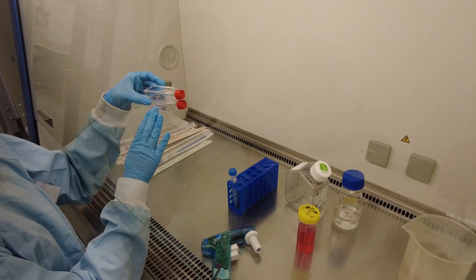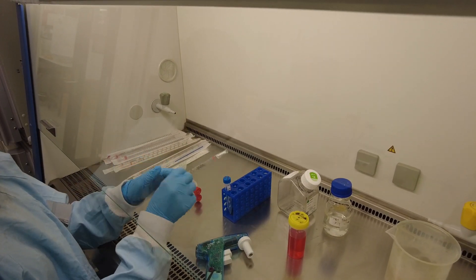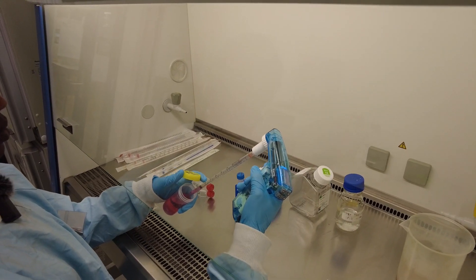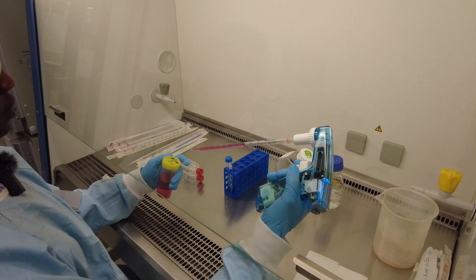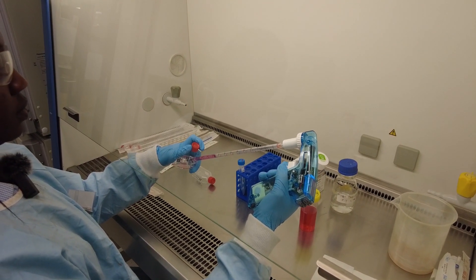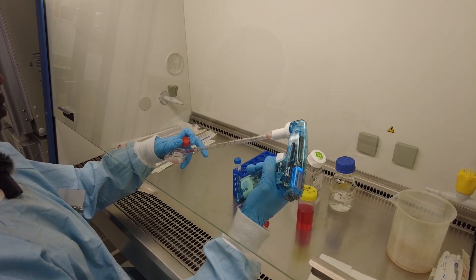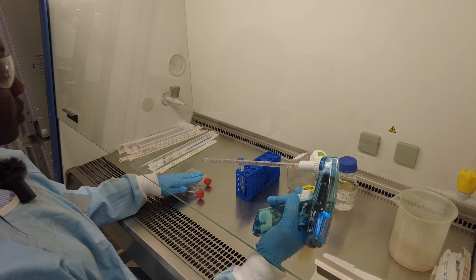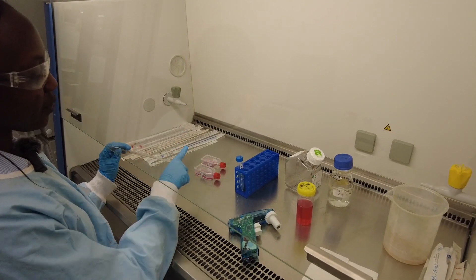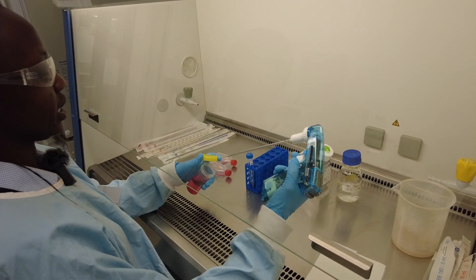We're going to put four mils of fresh EMEM media into each of the flasks, and then put the cells into the flasks as well. Four mil into each. Then we're going to put two mil into the cell tube and take one mil from it into each flask.